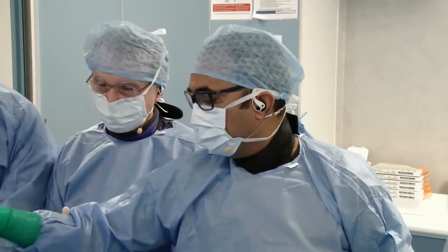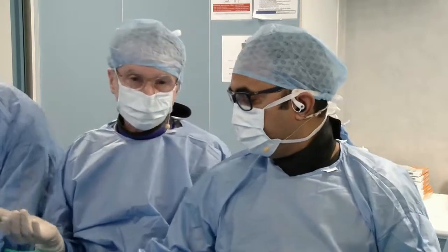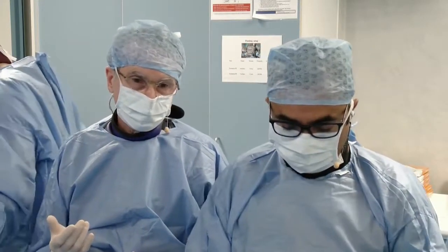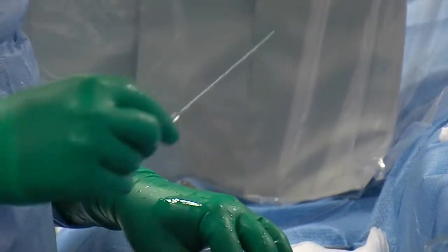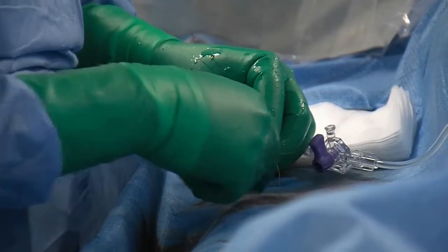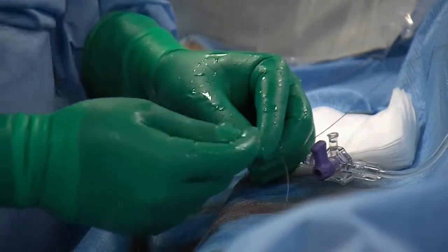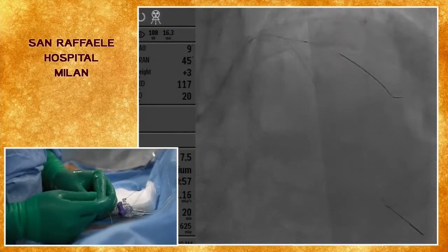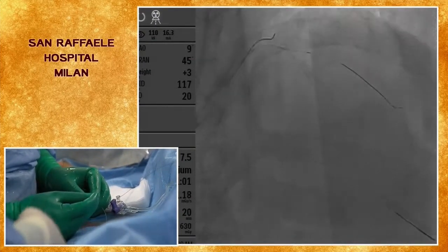I think, you know, once you have the wire distal with the J, you're going to need a wire in the diagonal later on. Honestly, when I was talking about using the same wire, I was referring to the LAD wire, to pull the jailed wire. Yeah, but we usually don't pull the jailed wire, right? Yeah, because it gives you a nice marker. But if the result is pretty good, you know, it's okay.